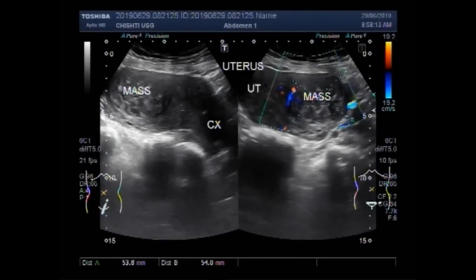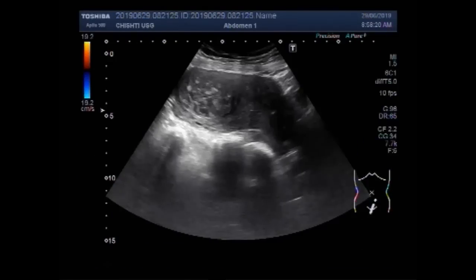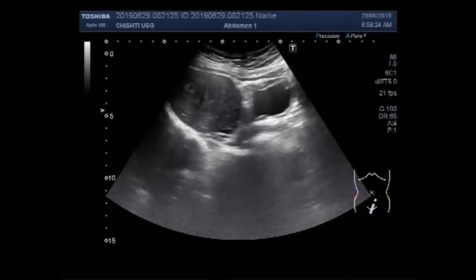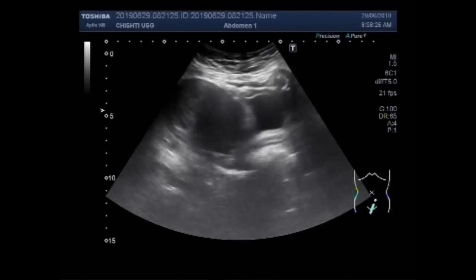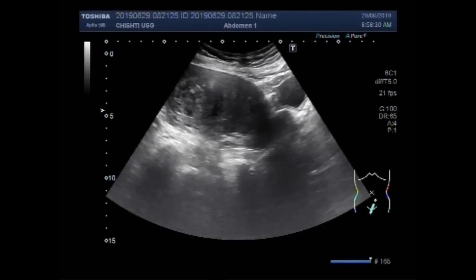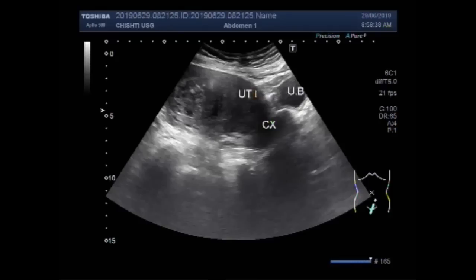Dear viewers, I hope you are all fine. This ultrasound video shows a mass in the distal portion of the uterus. You can see the urinary bladder, uterus, and mass in the distal portion of the uterus. This is the urinary bladder, this is the cervix and uterus, and this is the mass.